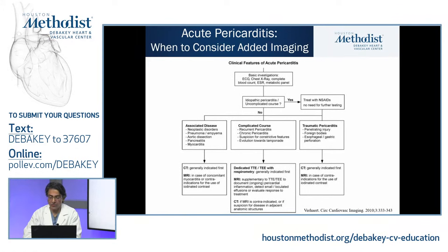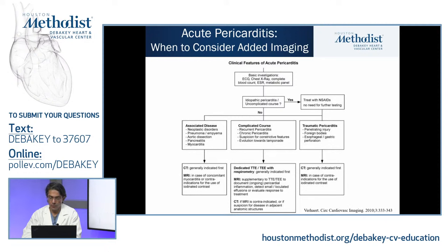This was a 55-year-old patient one week post-STEMI who had PCI to his LAD, now returning with positional chest pain. You can see a moderate circumferential pericardial effusion and on T2 imaging you can see brightness of both the visceral and parietal pericardium, and on LGE the myocardium shows evidence of the prior infarct — this is a case of post-infarct pericarditis. Advanced imaging is not necessarily needed for every case; patients who respond to treatment with NSAIDs and colchicine don't need further testing. However, for those with traumatic injuries, associated neoplastic disorders, aortic dissection, pancreatitis, or a complicated course with recurrent fevers and symptoms, consider advanced imaging.